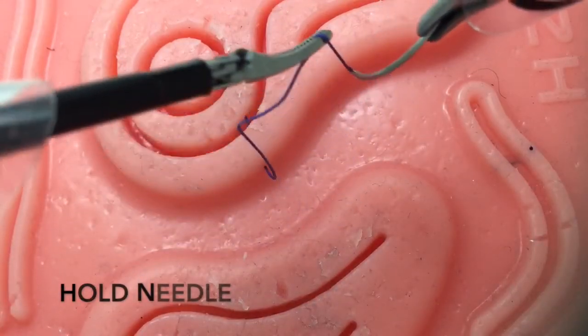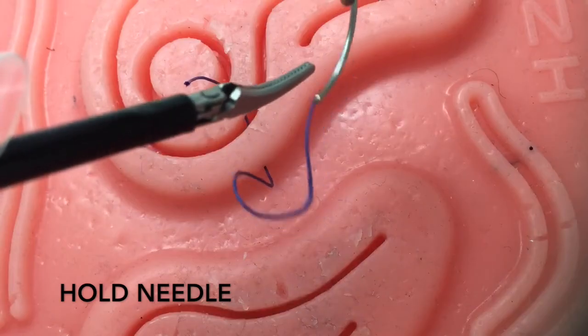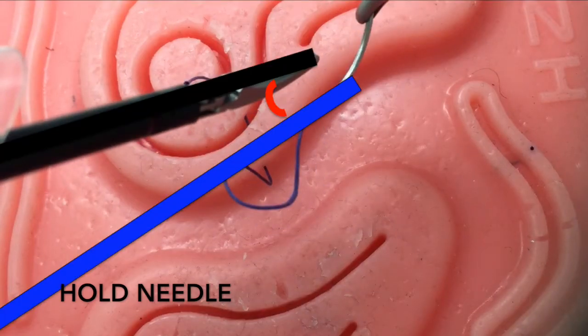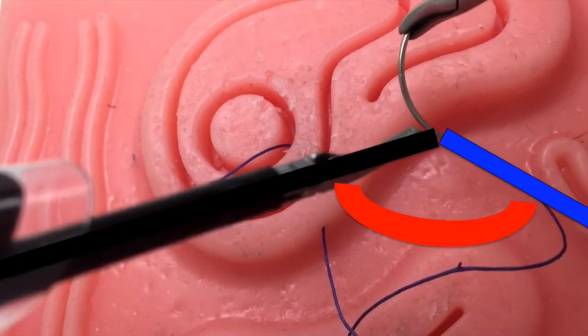For the hold needle technique, always remember to rotate the needle to line up with the suture and orientate it such that the instrument suture angle is minimized. As shown, a large instrument to suture angle makes throwing a knot very challenging.